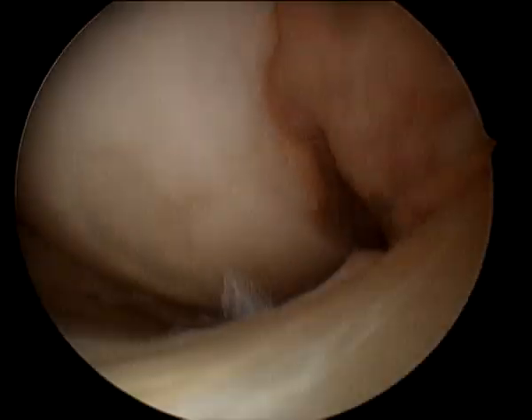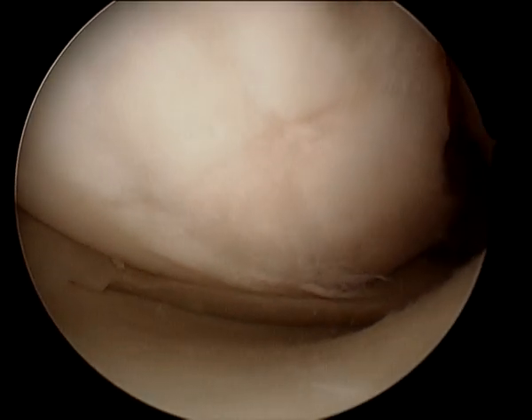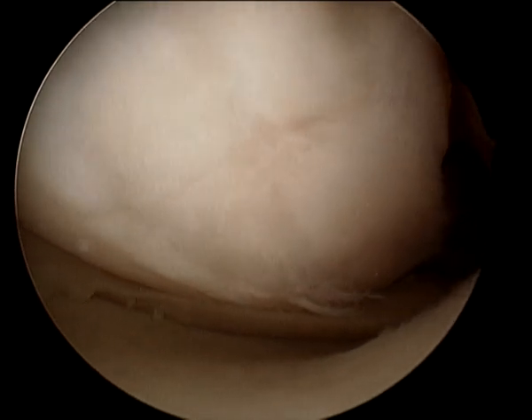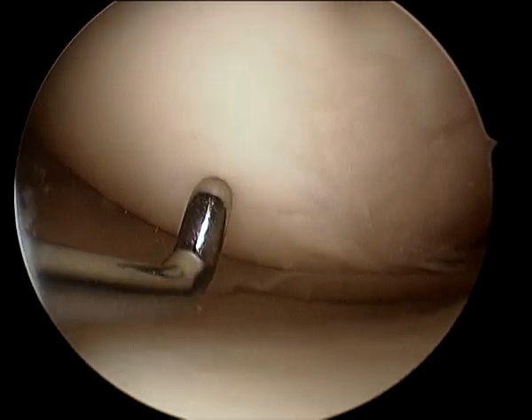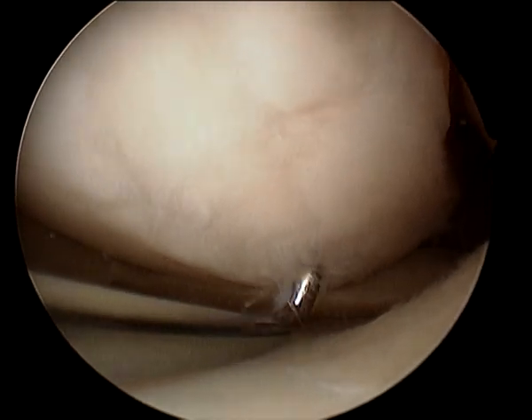As suspected, the problems are on the inside of the joint. You've got a little bit of damage to the end of the thigh bone, which is really not that bad. It's just some minor fronding of the cartilage. It doesn't look completely normal — that's normal cartilage there — there's a little bit of damage. It's a tiny little flap there, which will tidy up for you. It's nothing, really.